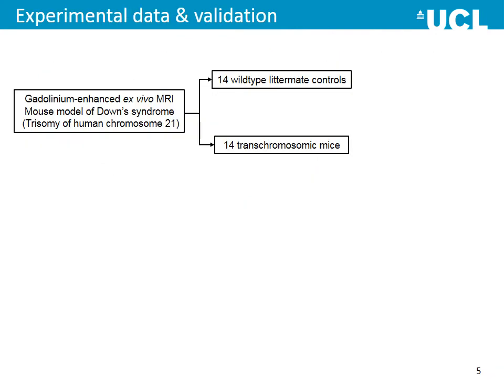The proposed method has been assessed on a dataset of gadolinium enhanced ex vivo T2 MRI scans of mouse brain, which includes 14 wild-type mice and 14 transchromosomic mice, which model Down syndrome.